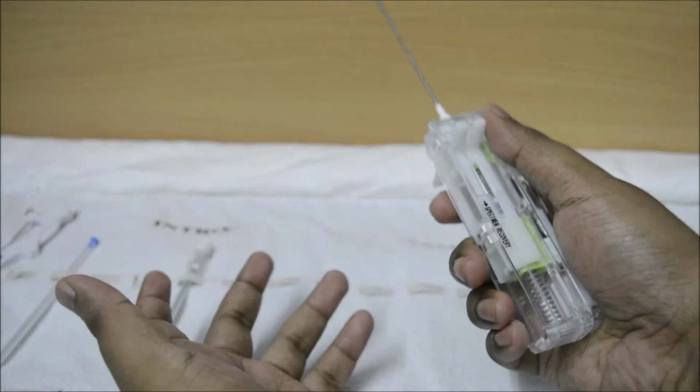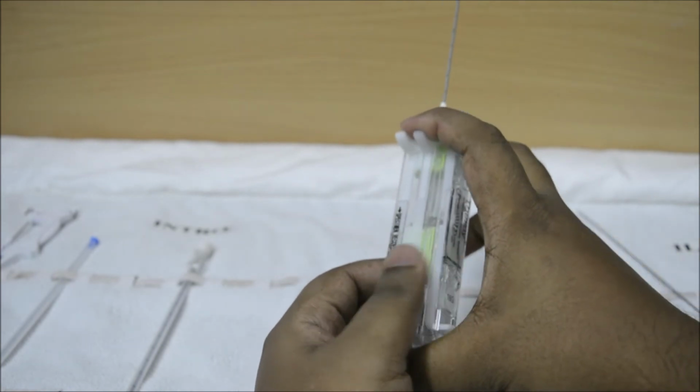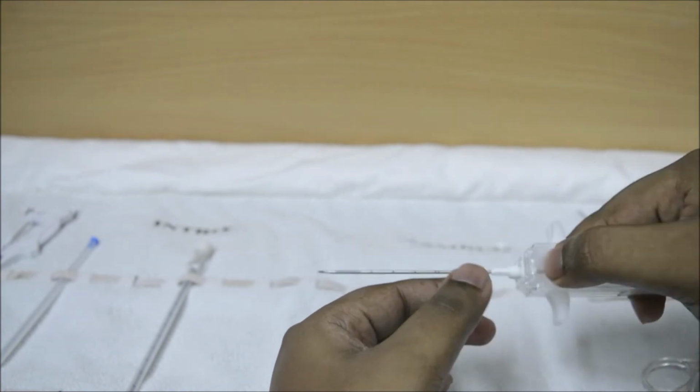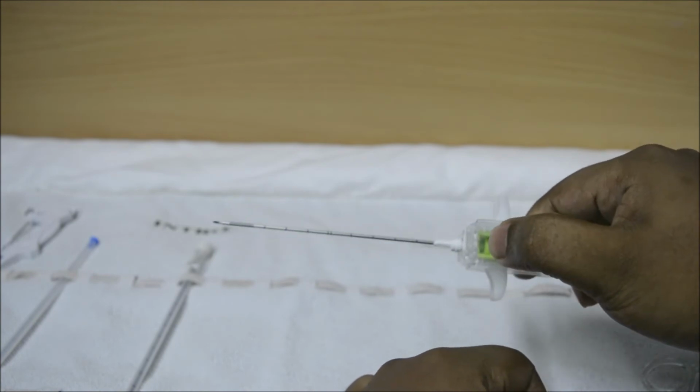Now again, for example, the tissue has to be collected from a liver tumor. Now the doctor may prefer using this trigger. So once the needle is inside, again one push, second push, the sample is collected.